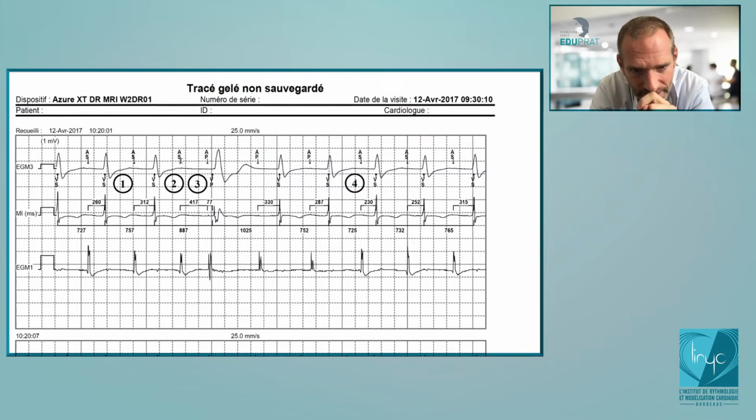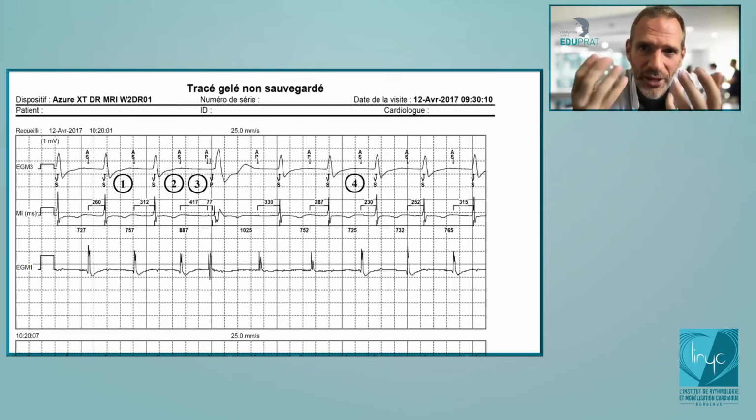At the end of the window, it will pace the atrium earlier than it should, and then pace the ventricle with an AV delay of 80 milliseconds. This short AV delay of 80 milliseconds is somewhere the signature feature of the MVP algorithm, and you will still see it in the new one.